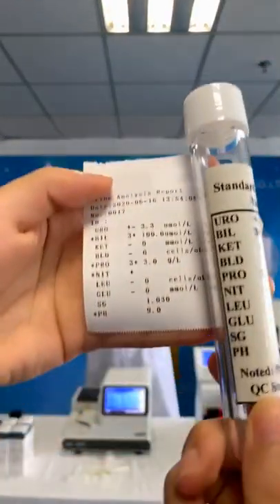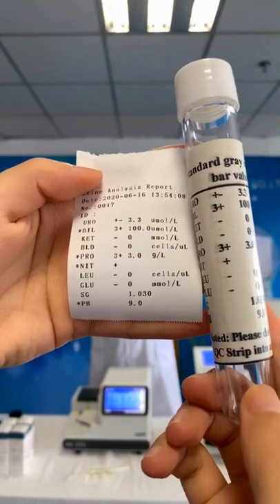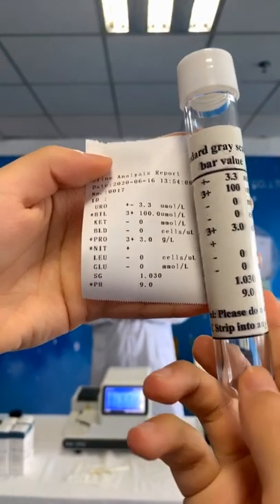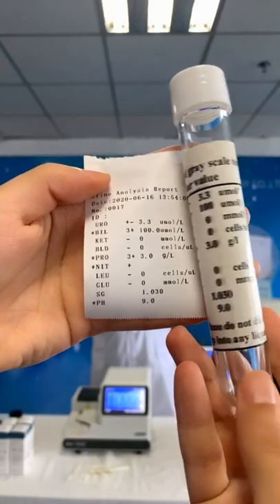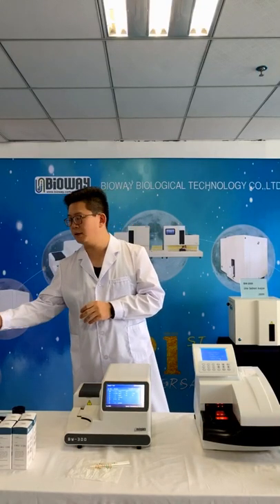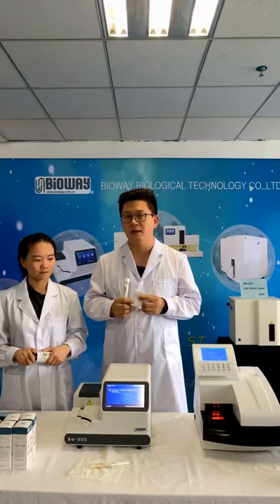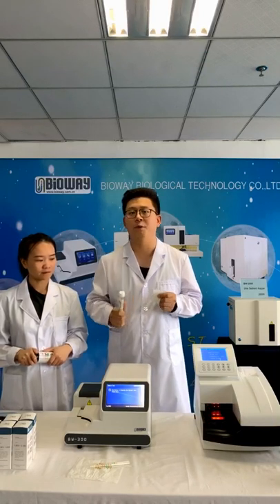Each item are identical, right? Yes. Totally. Okay. And the result: all the values on the strips are identical with the standard values. That means the device is running well and the results are accurate and reliable.